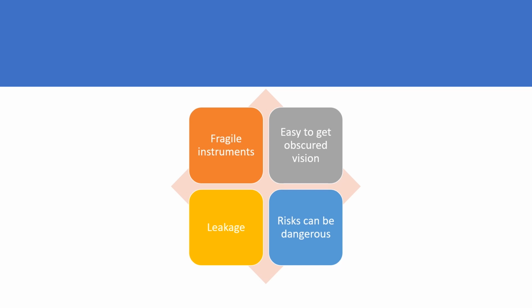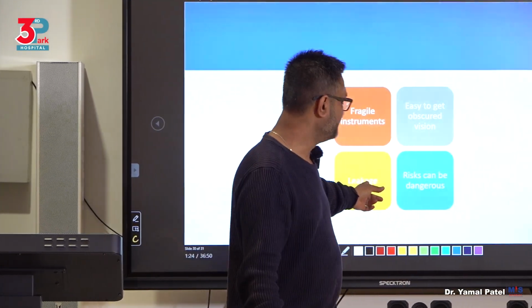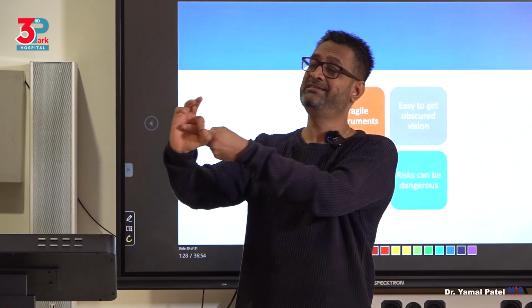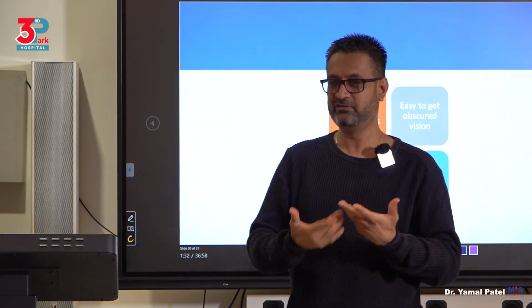There's risk of leakage. So you have to understand hysteroscopy and that there is leakage. So you can't over dilate the cervix. If you over dilate the cervix and then put in your scope, fluid is just going to leak out. What are you going to see? Nothing. That's why I don't dilate as well.